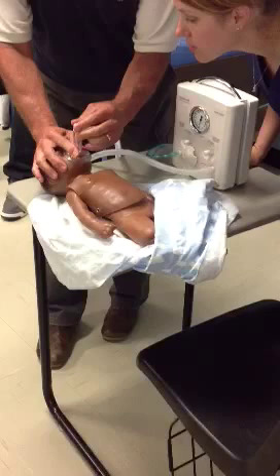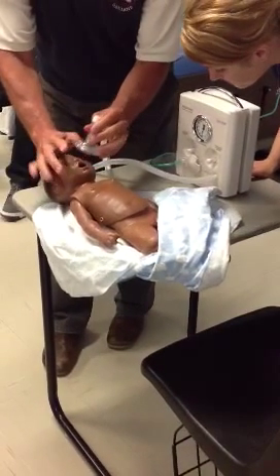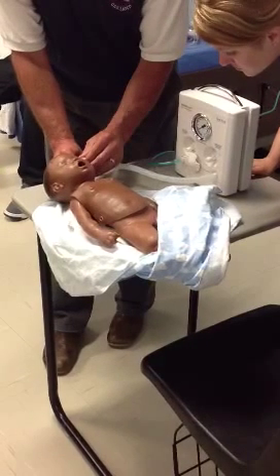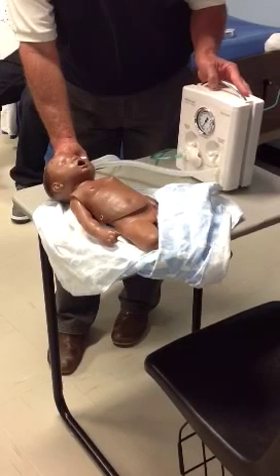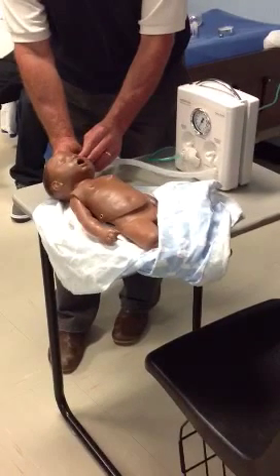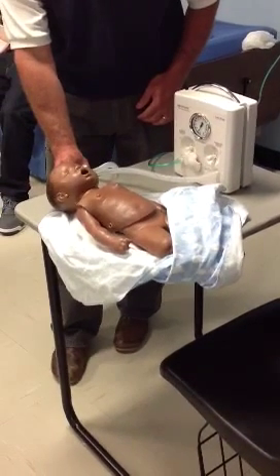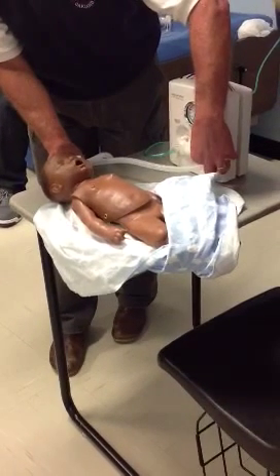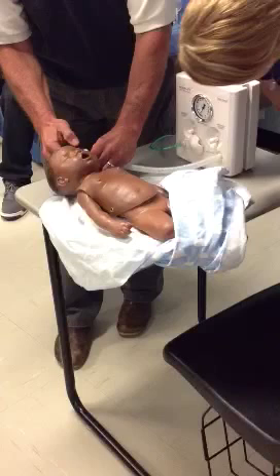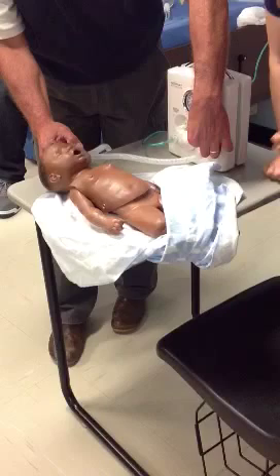That's a PEEP valve right there. I'm altering my PEEP valve. Can you see the manometer? I have five of PEEP right now. If I want to set my pressure, I simply use this knob right here. I hold down on this — I occlude the orifice — and there's my PIP. I alter it with this knob.